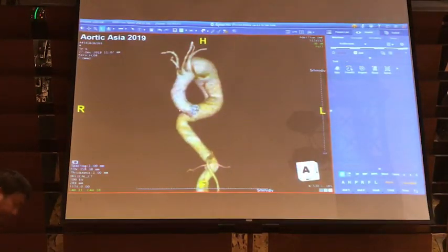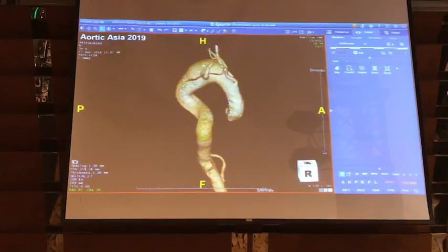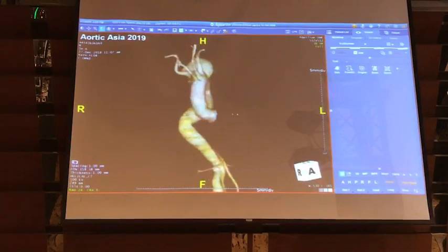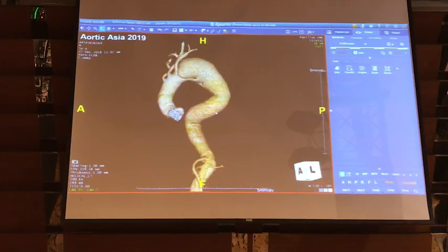If you get the graft up in this part, Bill, who was my planner hiding over there at the corner, tells me that this is not a good idea to get any custom-made fenestration devices up in the arch, because we are not sure how the holes would line up after this narrow section in the distal thoracic aorta. You may not even be able to get a graft up there in the first place because of the acute kink point. So if Bill tells me this is not a good idea, always listen to Bill and shy away from doing this. I'd like to see the opinion of the experts here. Maybe I can ask Ravi, who is looking at the monitor keenly.